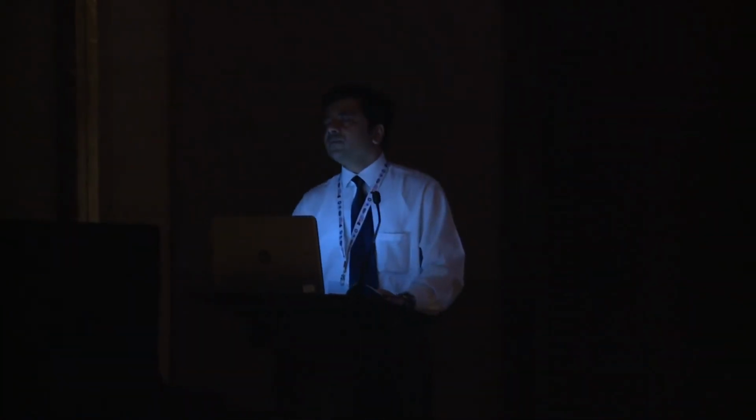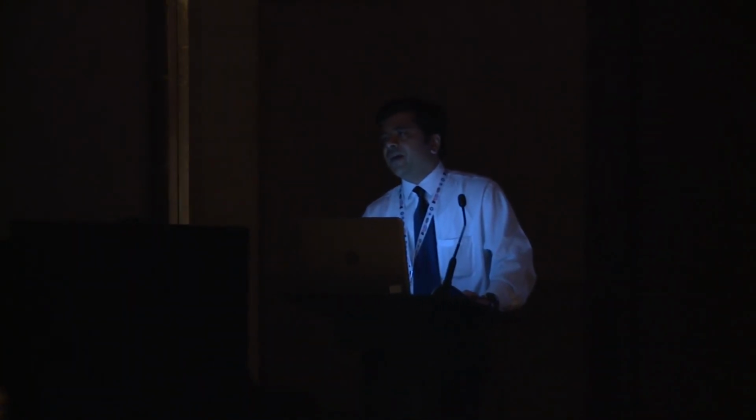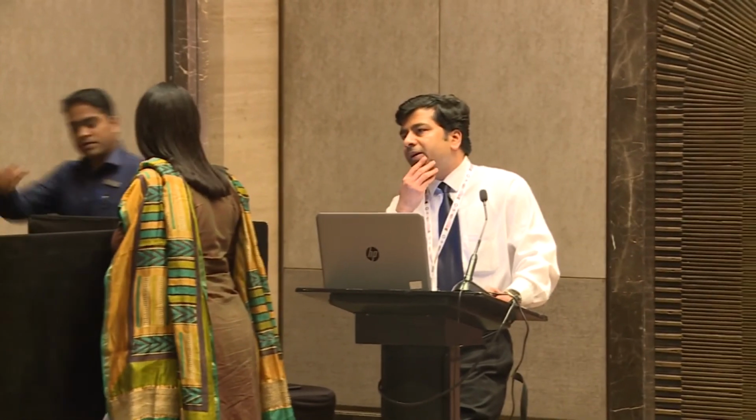Any questions? Yes, please. I've sometimes seen left atrial uptake in a sarcoidosis patient. Sometimes some oncology patients have them, without any uptake in the ventricle. Is it just a hodgepodge of different things, or could there be any value in that?